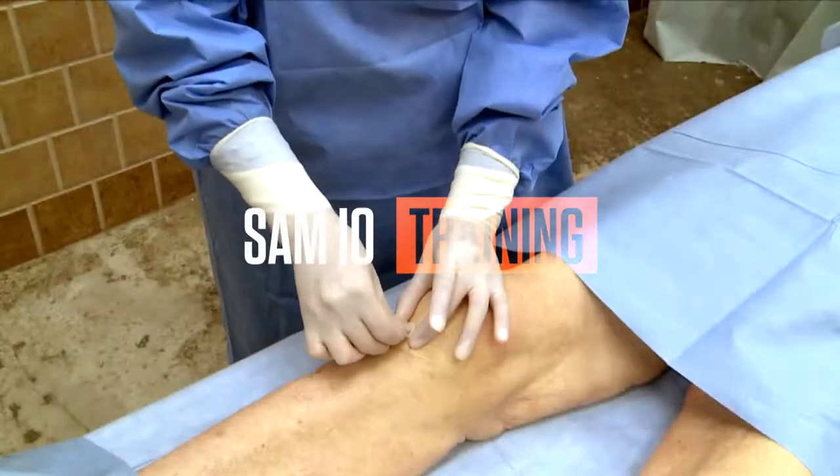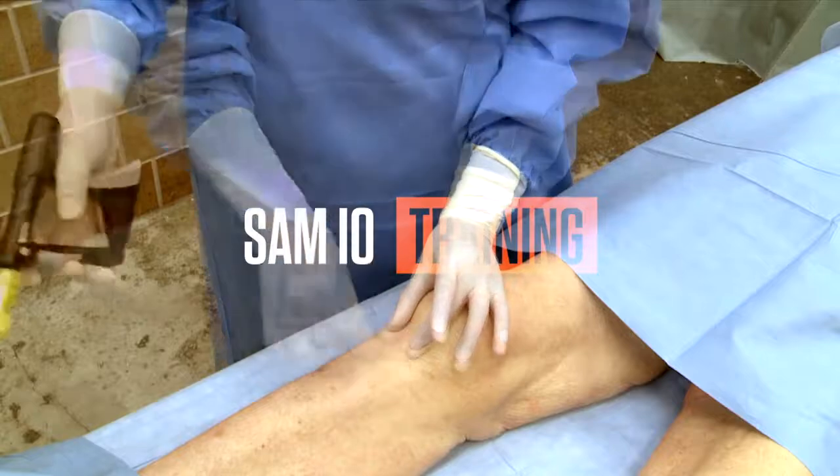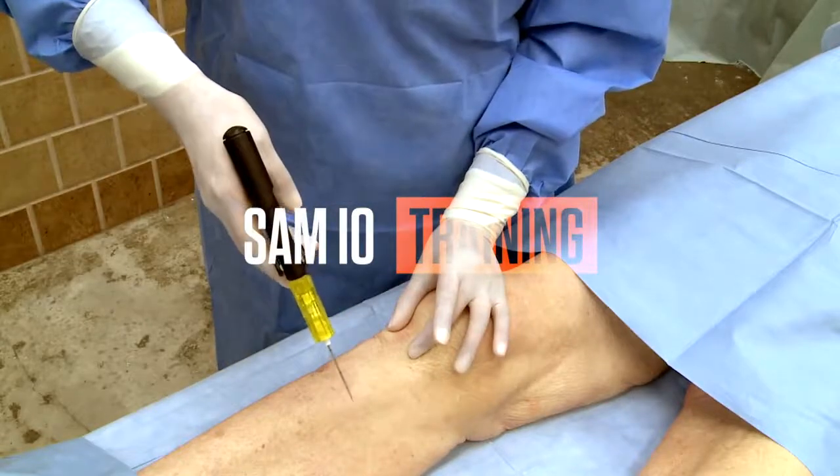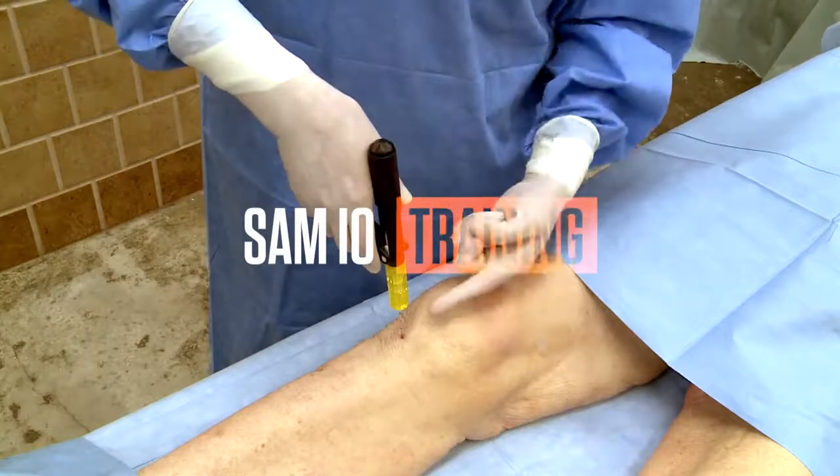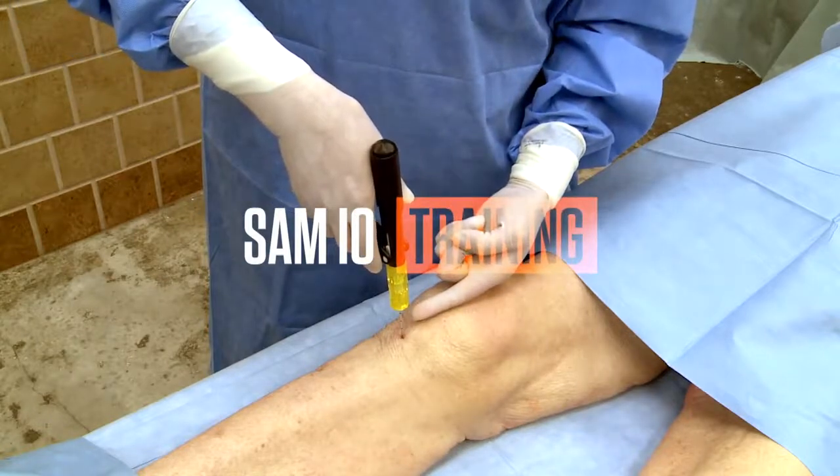The following program was created specifically for SAM Medical and the SAM-IO Interosseous Access System, orientation and training. Successful SAM-IO access, as with all medical devices, is predicated on quality education and training. This includes a comprehensive clinical understanding as well as hands-on skills practiced.